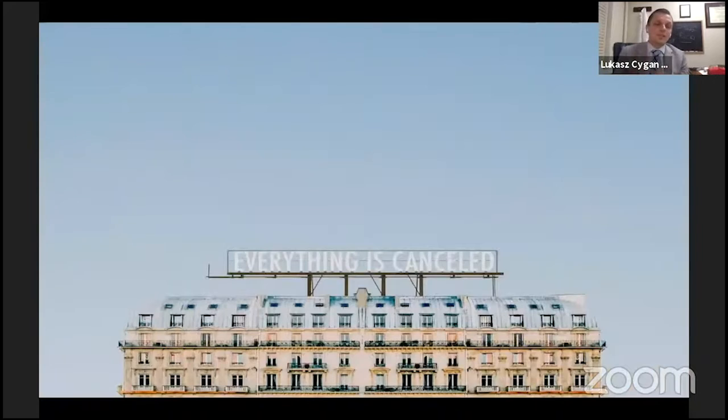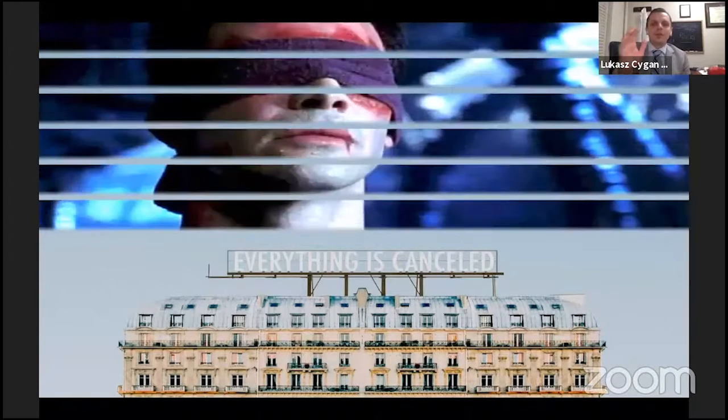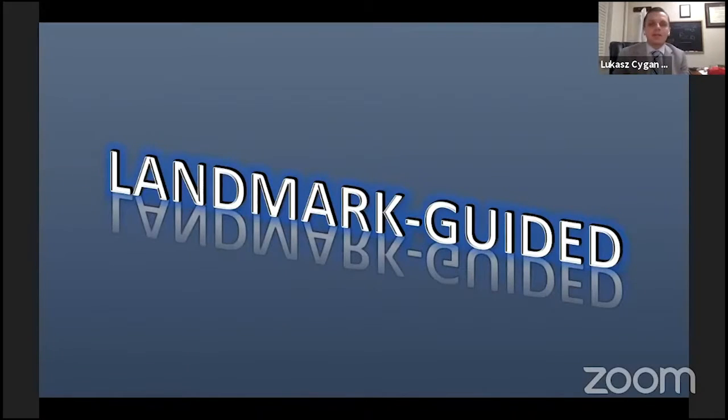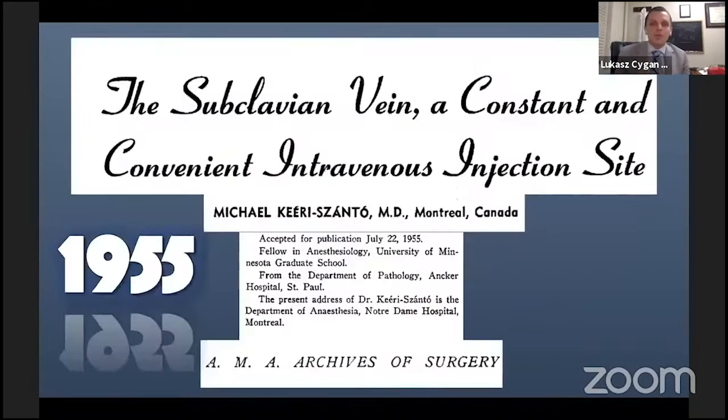And while I hope I still have your attention, in this world where seemingly everything is very easily canceled, I'd like to propose to everybody to cancel the term blind subclavian, throw it into cancel culture. While I understand I'm not visualizing the needle tip, I've yet to close my eyes or put a blindfold on while I perform or supervise the procedure. It is a landmark guided technique, and that's the way we should identify it as such. We use our in-depth knowledge of anatomy to perform it safely. And the anatomy really hasn't changed.